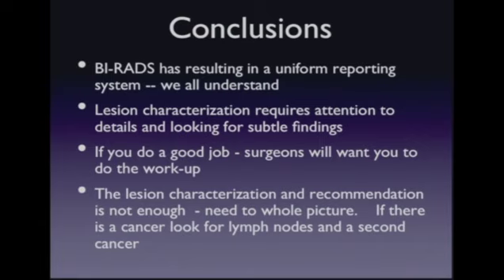Lesion characterization requires attention to detail and looking for subtle findings. If you do a good job, your surgeons will want you to do the workup. I think that when we started, our surgeons were a little reluctant to have us do biopsies, and as we've done a very good job also evaluating lymph nodes and looking for other lesions, we can present them with a very high quality examination and provide them the information they need. I think this eliminates a lot of problems with disagreement between who should be doing what.